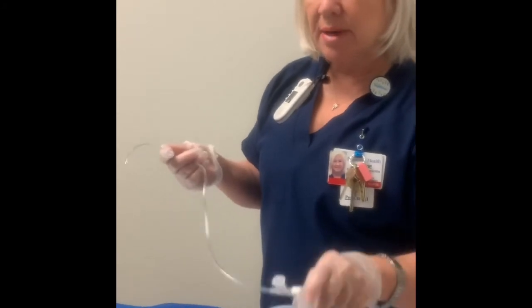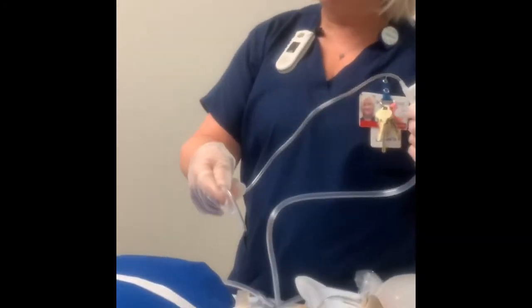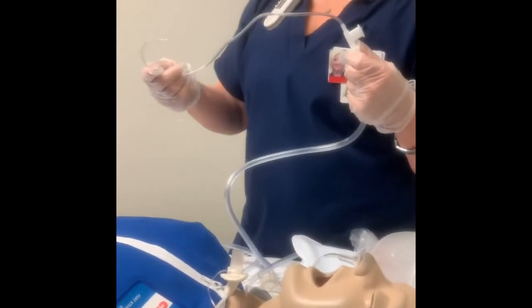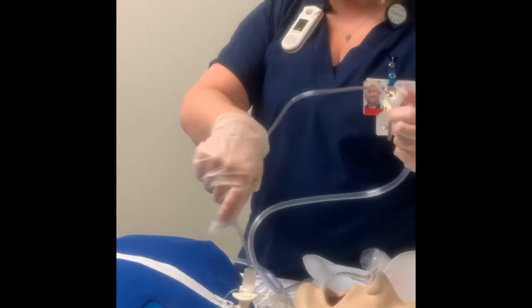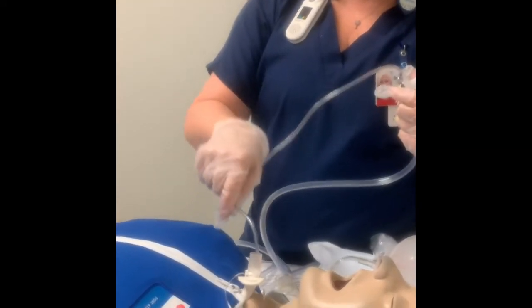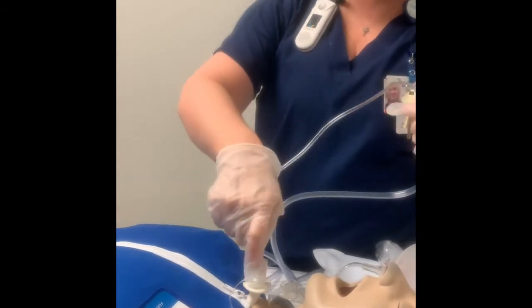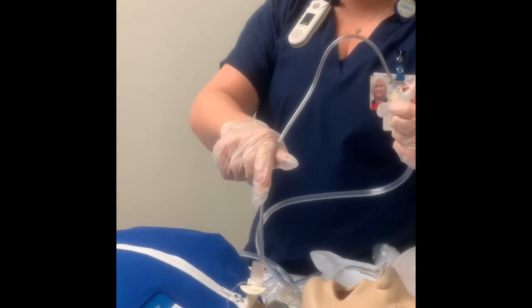But let's say, for instance, I'm getting ready to suction this patient, but there's a bunch of stuff right up here in the very front. Do I still want to continue going down? No. Usually you want to go in just enough to get all that, bring it out, let them get their wind back, and then go back in. Maybe do a little bit deeper suctioning on the patient. Okay? Questions?